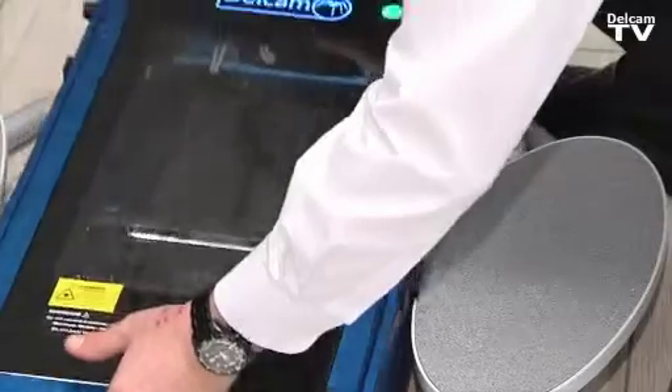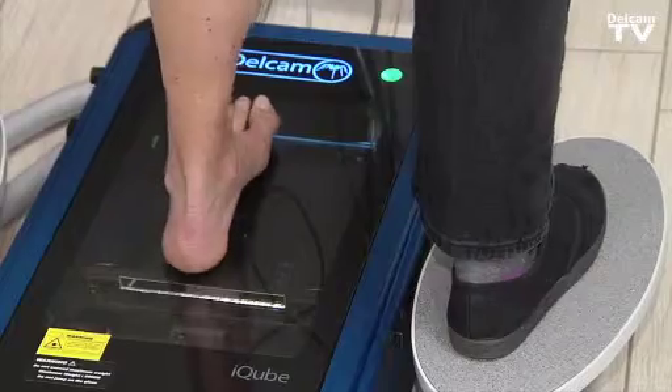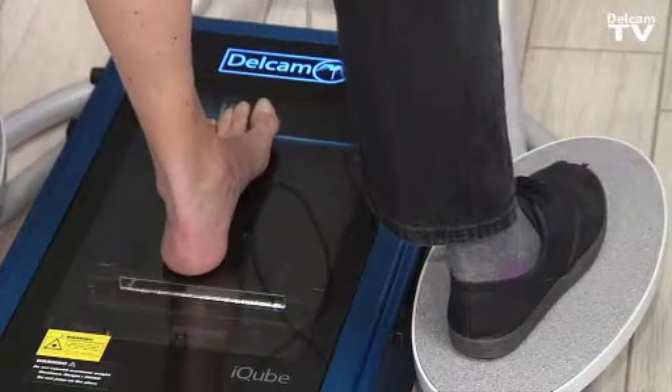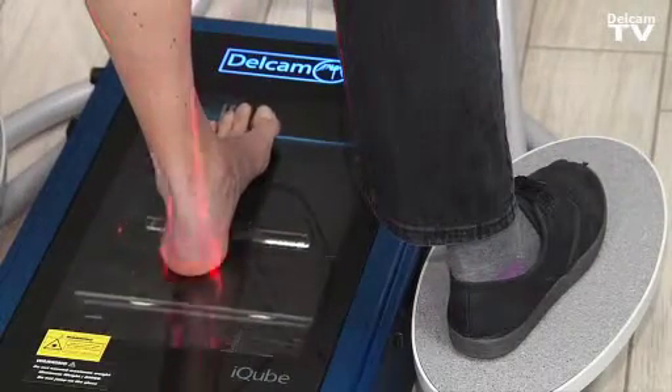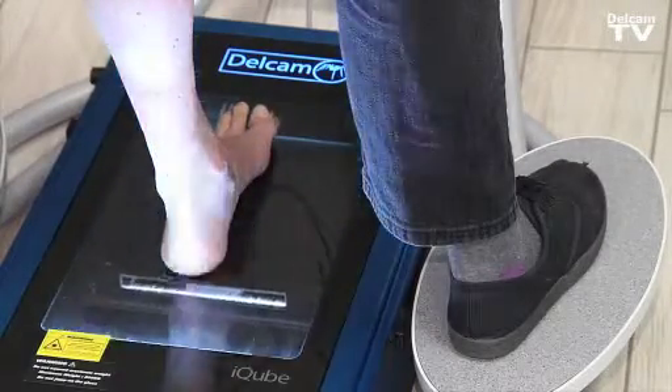By just putting it in position, our foot model will stand on the iCube stand, place the foot in, and we can simply select to scan the left foot. The iCube scanner then captures the 3D image of the foot.